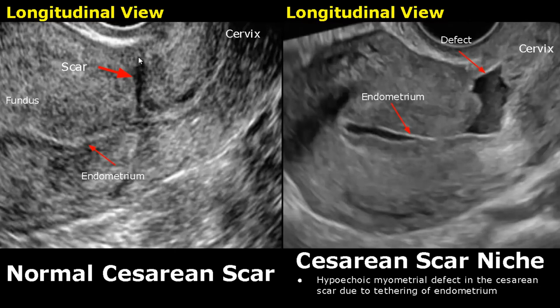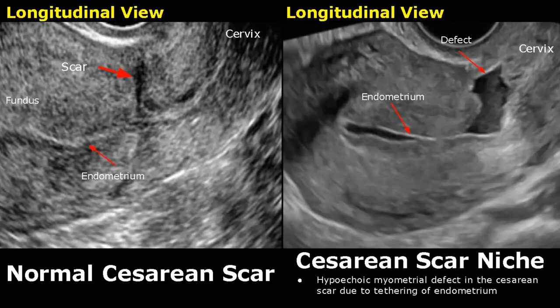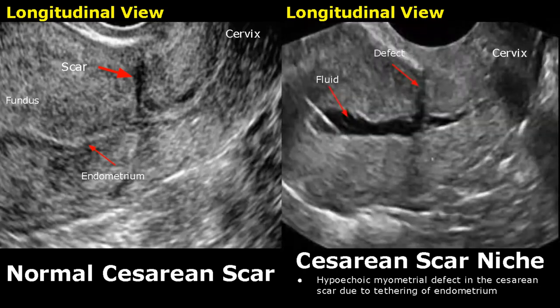In a caesarean scar niche, there will be a hypoechoic defect in the myometrium at the site of the caesarean scar due to tethering of endometrium. Blood has accumulated in this defect. The defect has various shapes. This is an irregular shaped defect. This defect has a linear shape.